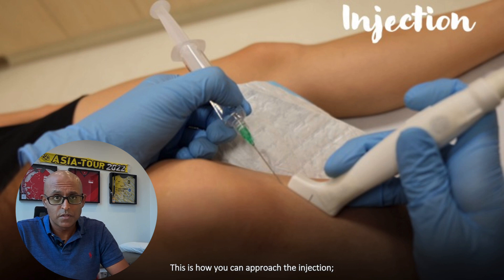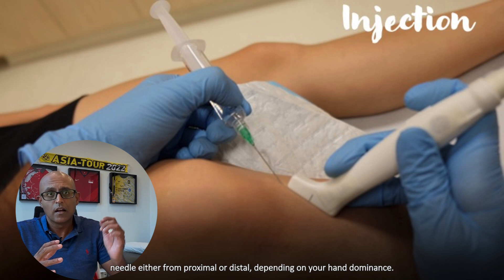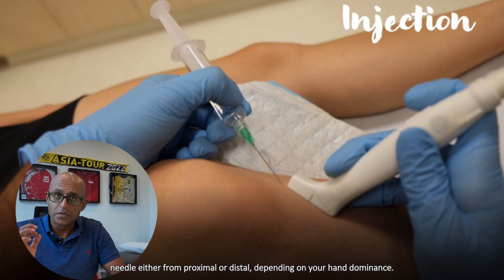And this is how you can approach the injection. With the transducer in a long axis orientation over the PES anserine Bursa, you can introduce the needle either from proximal or distal, depending on your hand dominance.